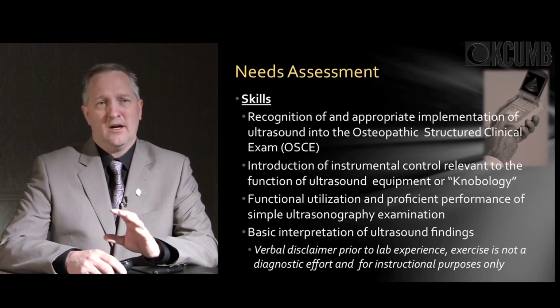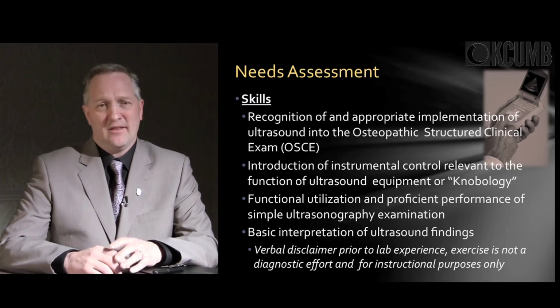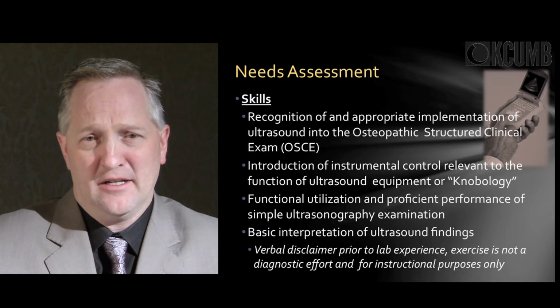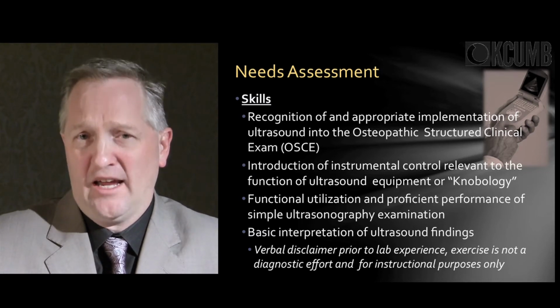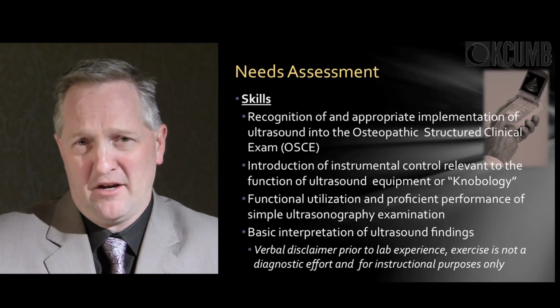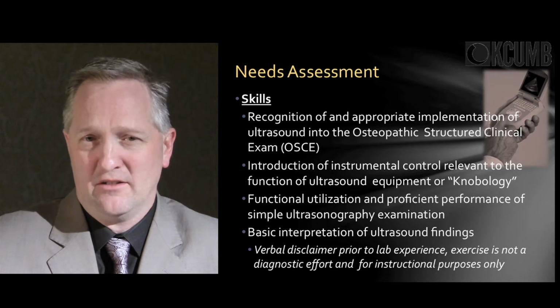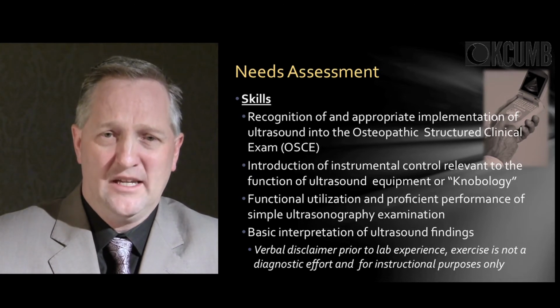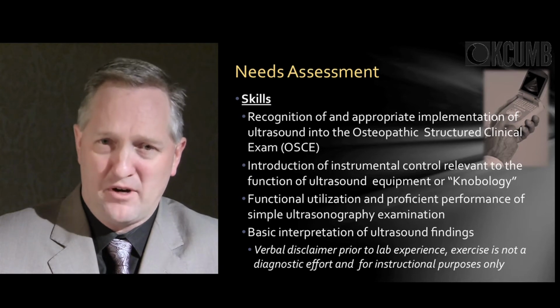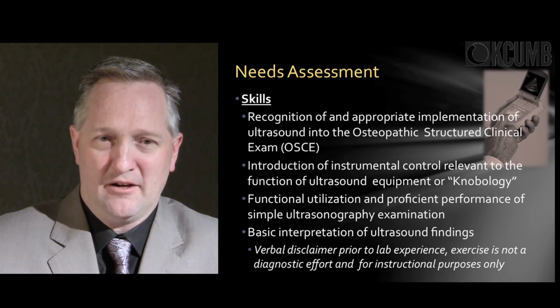Now, in all of our labs, we have a very important statement that this is a simple educational experience alone. We emphasize that this is not a diagnostic effort. So if perchance there is some individual in the lab that is being ultrasounded and there is a pathology that could have or should have been identified in ultrasound, we kind of put that barrier there to let them know that we are not trying to diagnose medically. This is just a skill set to have the students begin to learn the introductory processes of using the equipment. It also kind of covers our liability carrier a little bit on that.